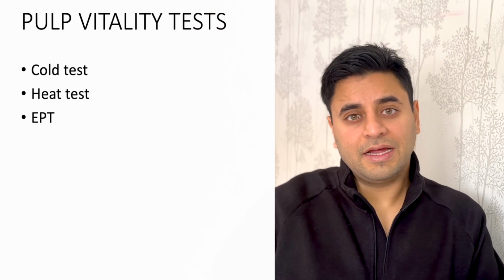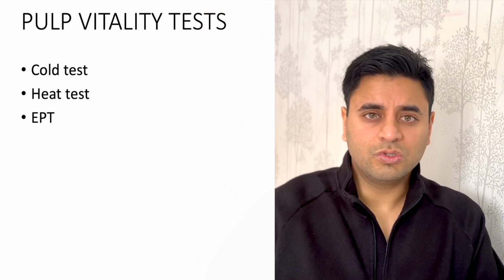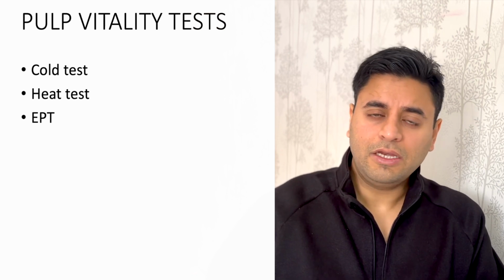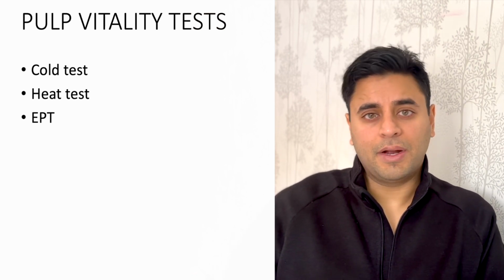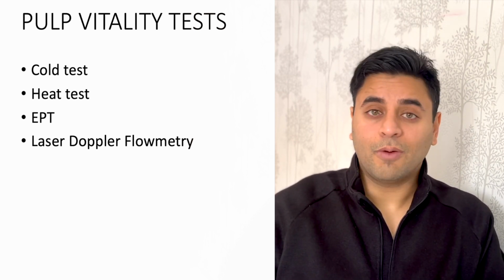And if you want to find out whether the tooth is dead or alive, and there is no chief complaint based on heat or cold, then you go for an EPT, which is electric pulp test. There is also a very specialized test which is called laser Doppler flowmetry.